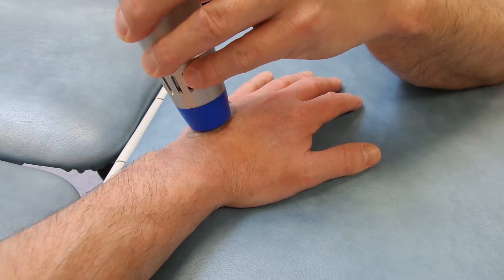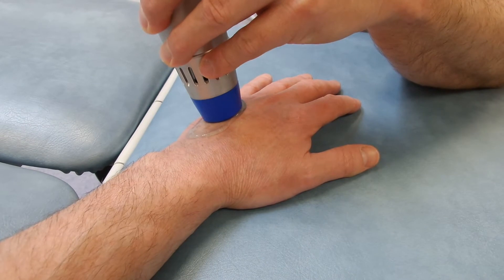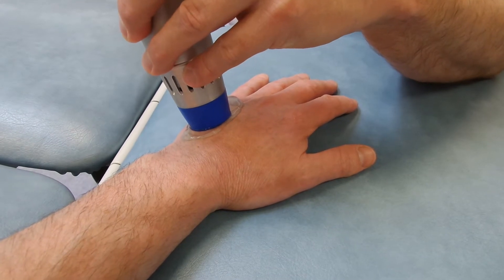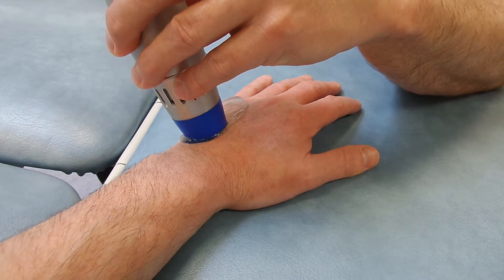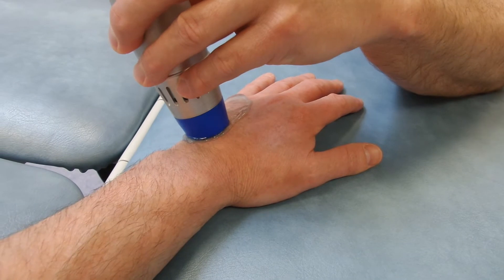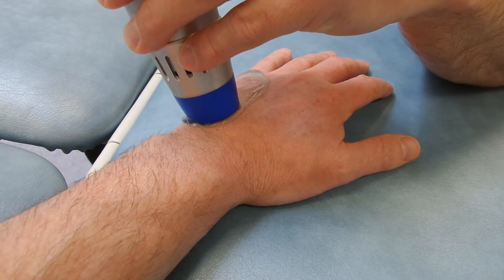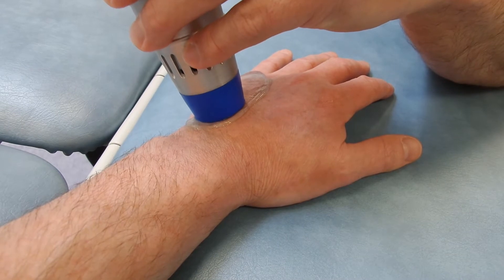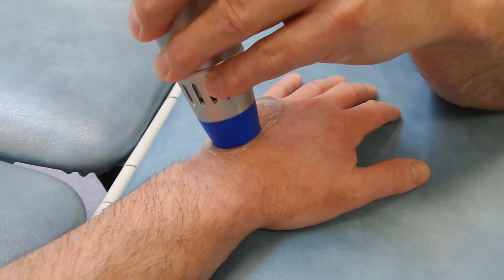Are you ready? That's completely comfortable. You can hear it there. On this one you can hear when it's hitting harder stuff. That's lighter. That's definitely hitting it. Now interestingly, I mean that's it — that is at the heart. That's actually reproducing my pain. You can hear the difference there.